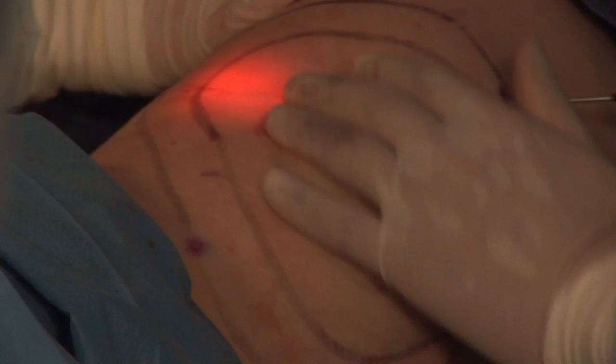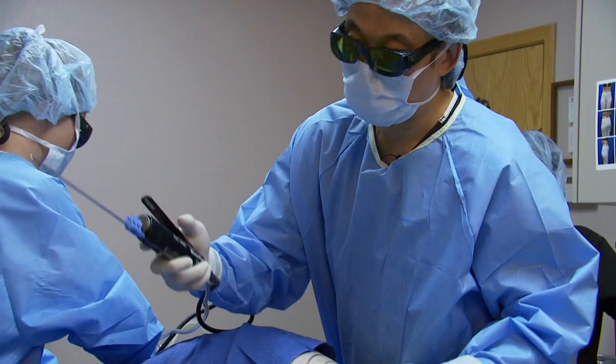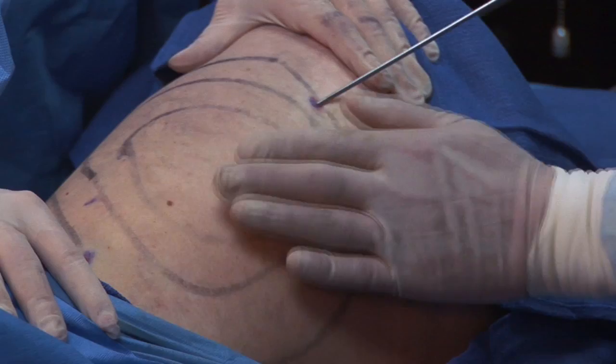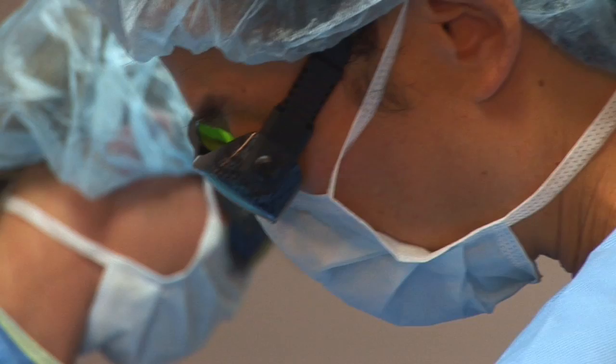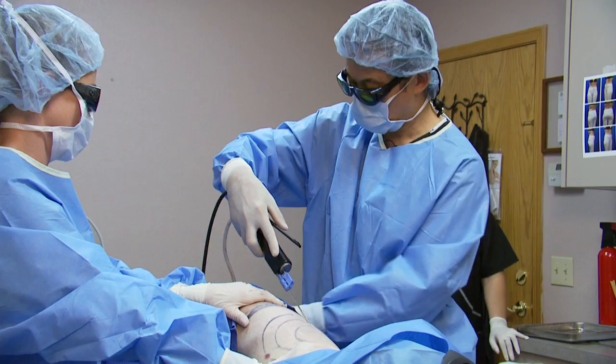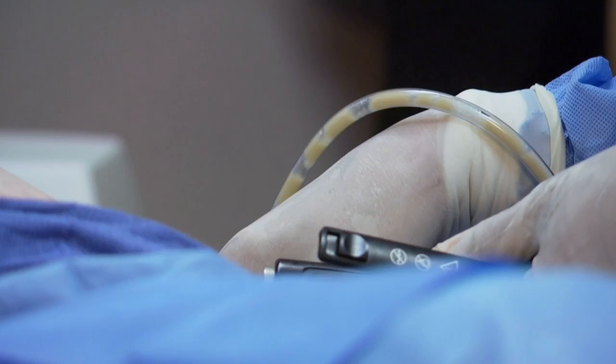We've now delivered 8000 joules to the right flank and 8000 joules to the right saddlebag area. This is our powered assisted liposuction cannula. We're suctioned on, we're all set. Do you feel anything at all? No. Good. So right now all I'm doing is suctioning out the liquefied fat. And you can see this is the liquefied fat — the melted fat has a grayish dusky look, because that fat has been melted and liquefied.